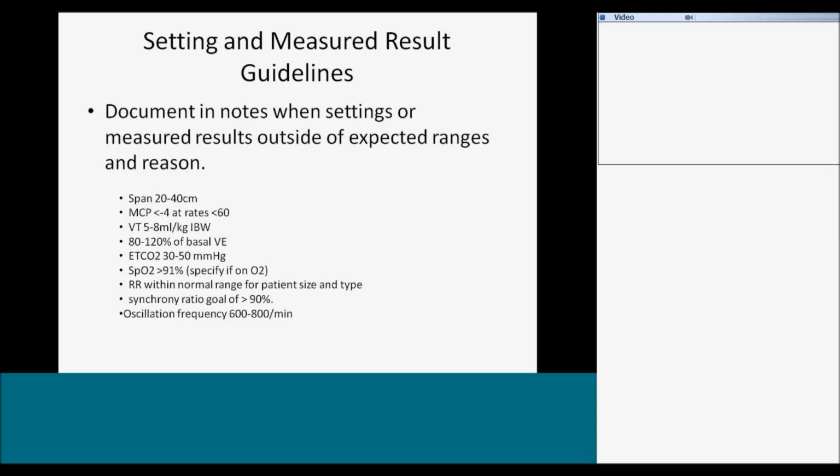The thing to bear in mind as you adjust span is what we put on the outside of the chest, only about a fourth to a fifth of that centimeters of water pressure is actually delivered to the lung. So it's not like a 40 centimeter peak pressure on a positive pressure ventilator. It's far less potential for damage to the lung.